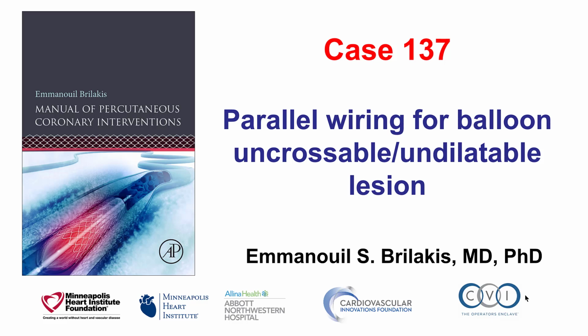Hi, this is Manos Brilakis, and this is case 137 for the Manual of Percutaneous Coronary Interventions. This is a challenging case of a balloon uncrossable and undilatable lesion.